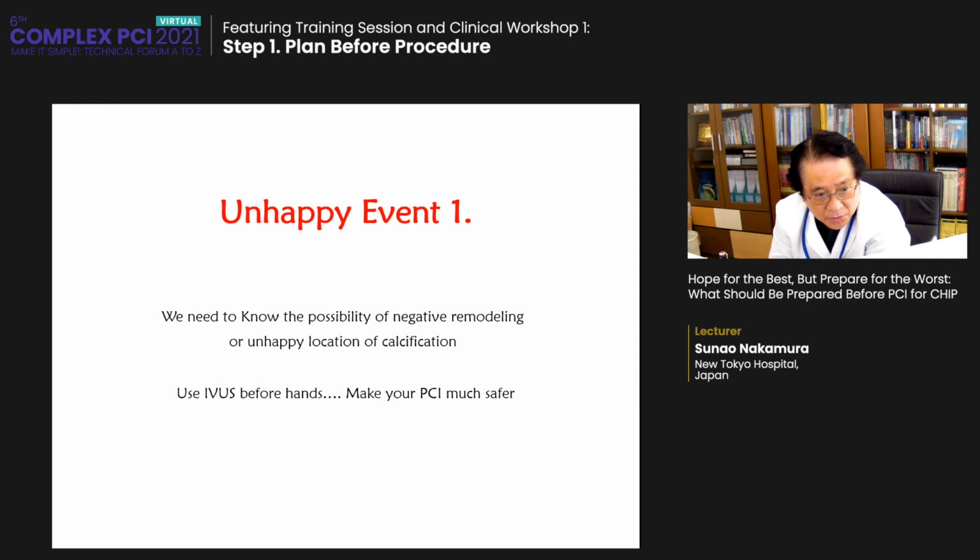Today, I would like to show the 3 unhappy events. Please watch and feel and think. First case is a perforation.